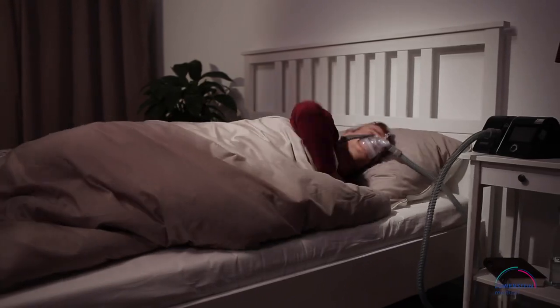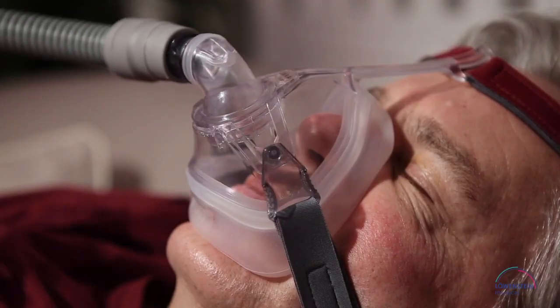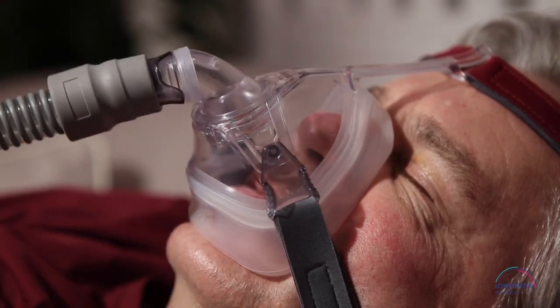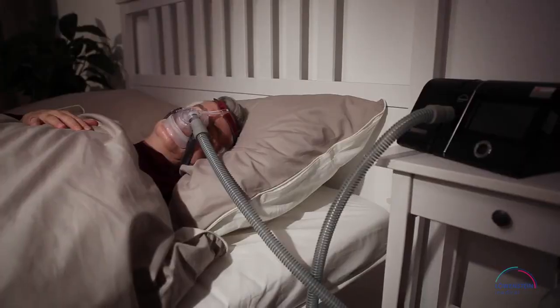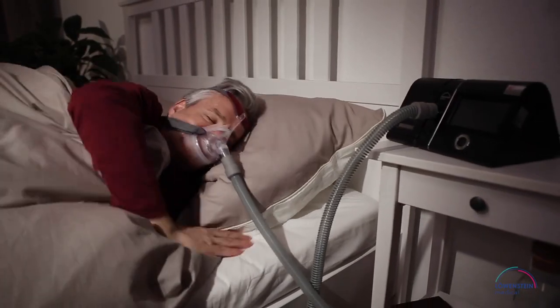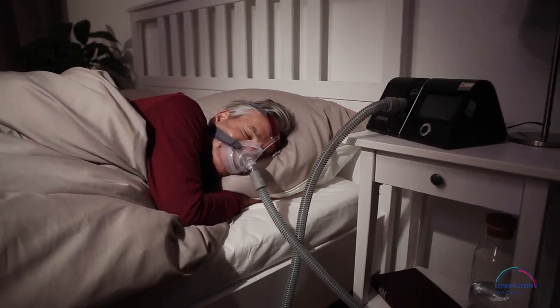You naturally move around while you sleep. Your mask is equipped with a ball and socket joint to ensure that it fits your face snugly and securely. Because the joint can rotate 360 degrees and swivel in all directions, the mask cannot slip out of place.